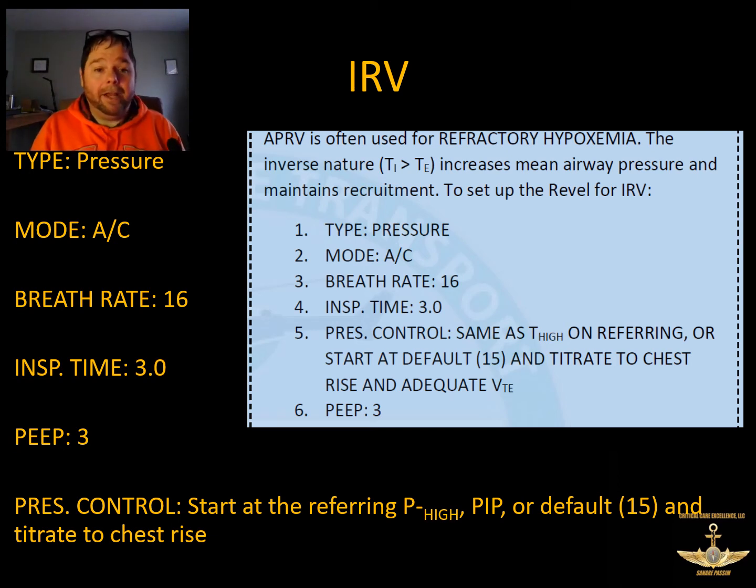And then after that, you're going to titrate your oxygenation with your PIP, your pressure control number, because that's how you're going to get them to oxygenate, by increasing that pressure. And some of those pressures can get kind of high, especially if patients get really, really sick, which is, again, why we reserve this for the sick patients who just won't oxygenate any other way.